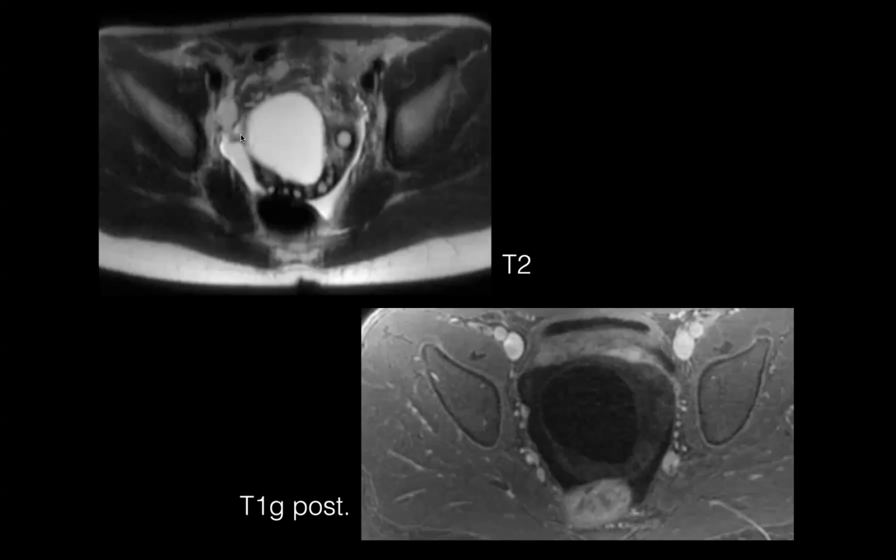Yeah, so there's definitely more fluid there, right? You see this follicle's gotten way too big. And not only that, but there's fluid all around the ovary. Do you see all this fluid right here, these bright areas?